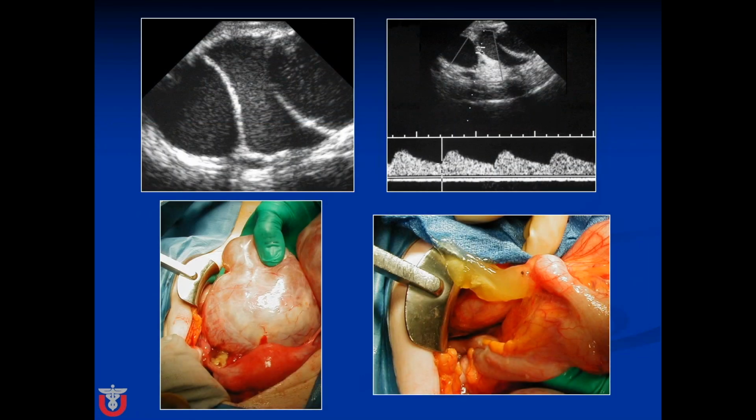So now we're using our ultrasound as part of our physical examination. Okay, so what else is in our differential for low-level echoes? Well, mucin is another one. And this is an ovary, and mucinous tumors of the ovary are common. This is a mucinous cystadenoma. See, we're using our Doppler, and we can see there's flow in that septation. You can see it here being removed. Here's the uterus. That's the normal size uterus. And you can see the mucin coming out of it.